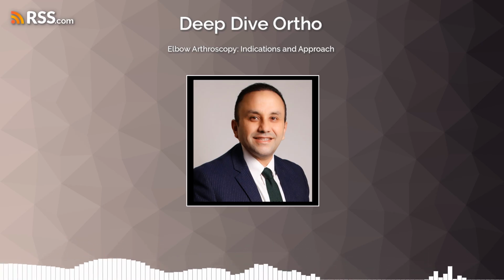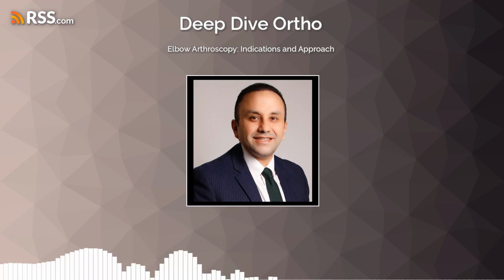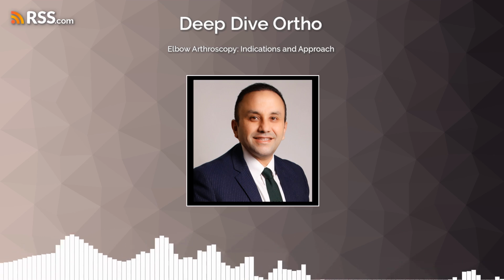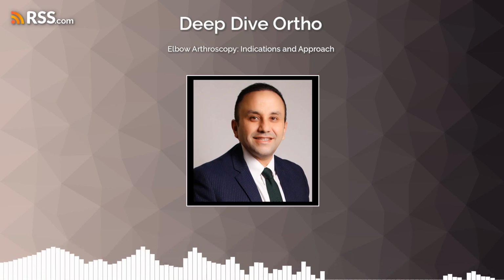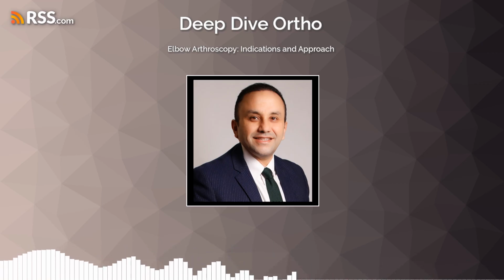Exactly. The arthroscopic technique usually begins by establishing a proximal medial portal using a nick and spread technique, aiming the trocar towards the joint center. Seeing fluid come out confirms our intra-articular entry. We then create a second portal, typically the proximal anterolateral portal, often using an outside-in technique with a needle to precisely localize the optimal insertion point.